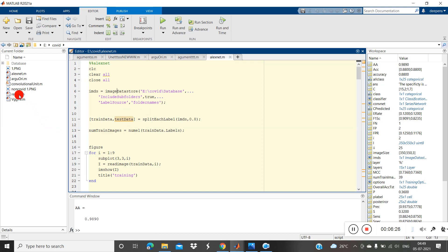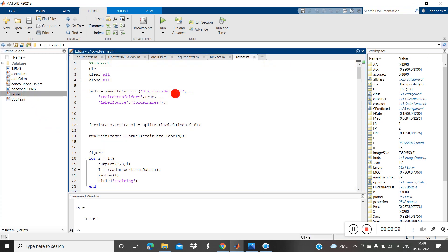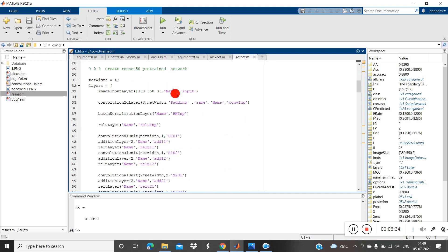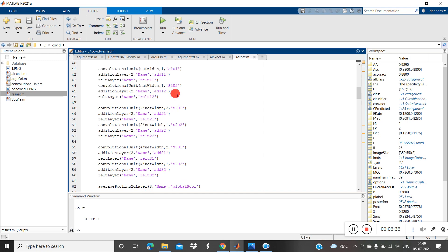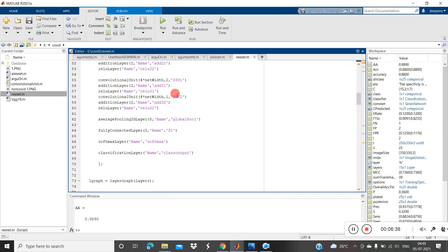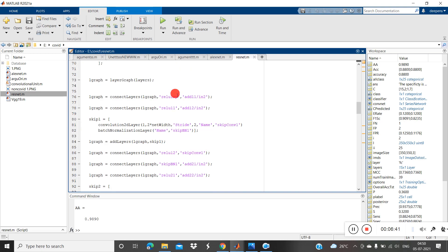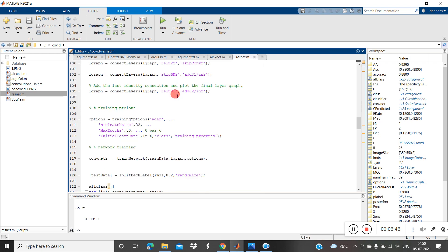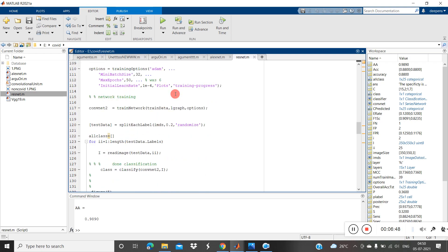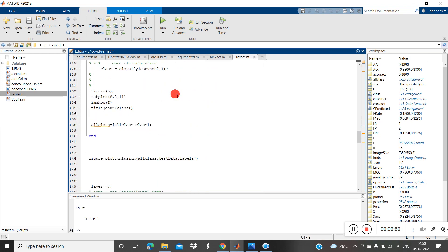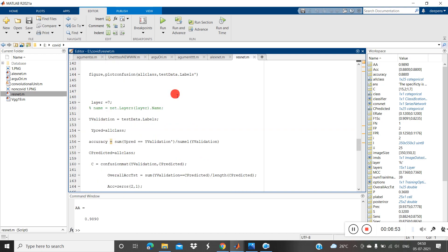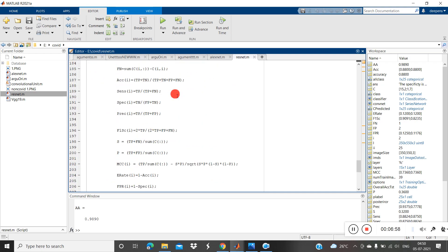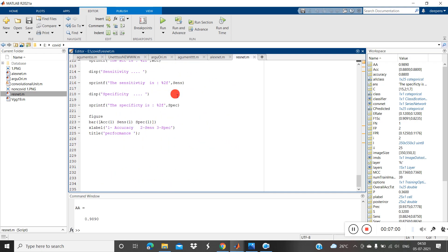Now I'll show you two more networks. This is for the residual network, or ResNet-50. The procedure is the same — we just change the network structure to use ResNet-50. Here also we find the confusion matrix, accuracy, sensitivity, specificity, and all other parameters. Finally, we also calculate the ROC curve.